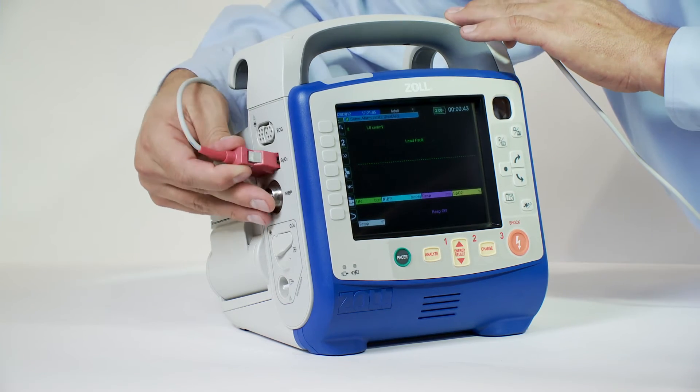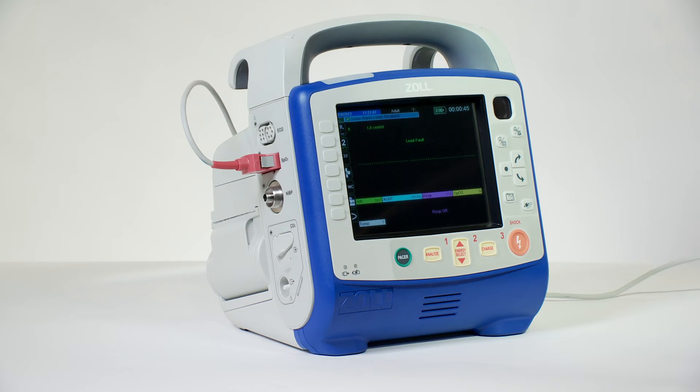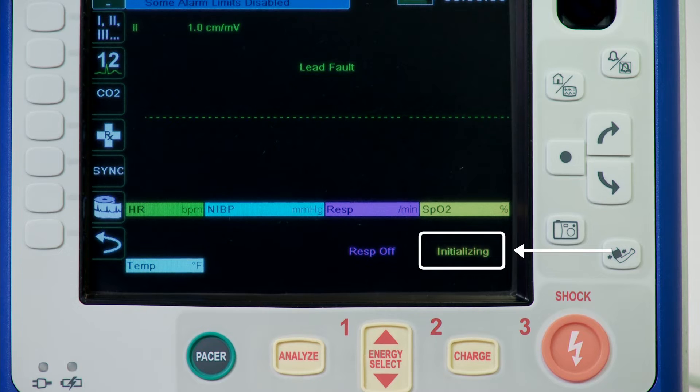Plug the sensor cable into the SpO2 socket on the side of the device. When the connection is made between the SpO2 sensor and the unit, the message 'Initializing' appears in the SpO2 display. After a brief delay, the unit displays the SpO2 measurement.